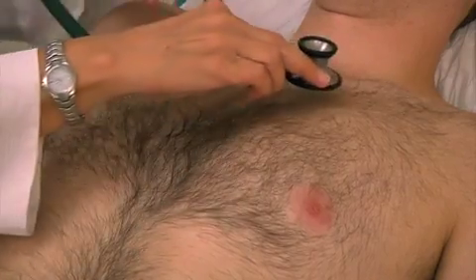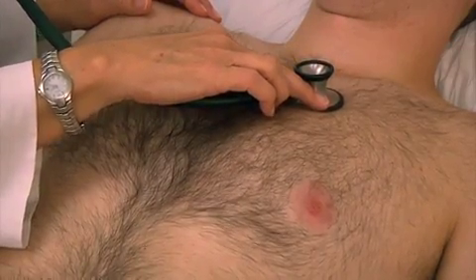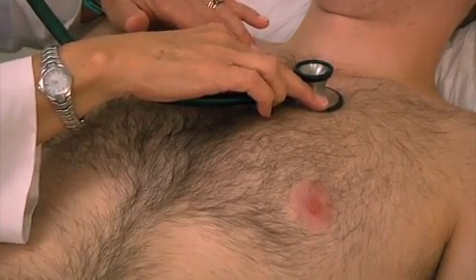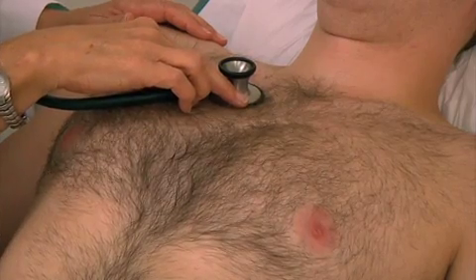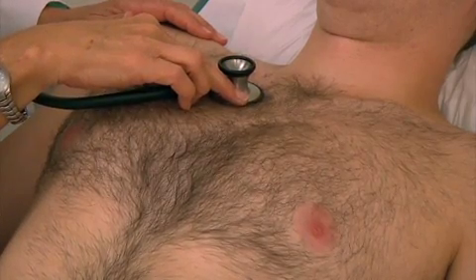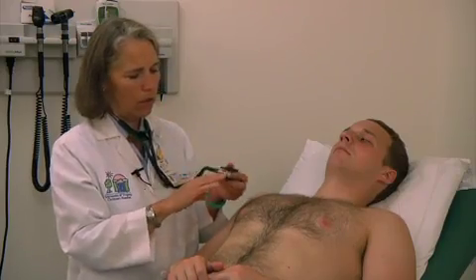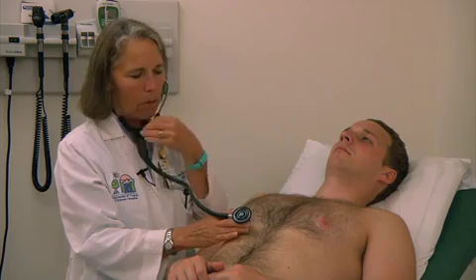And listen to the pulmonary area, 2nd intercostal space, parasternal area, and then I move it to the aortic area, 2nd intercostal space, roughly, parasternal as well.